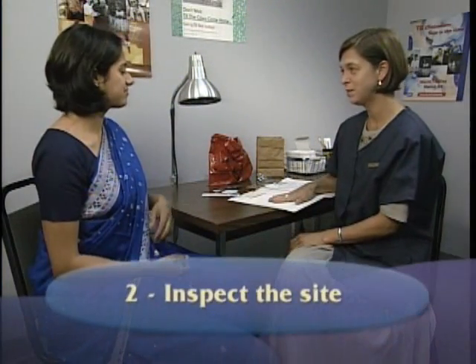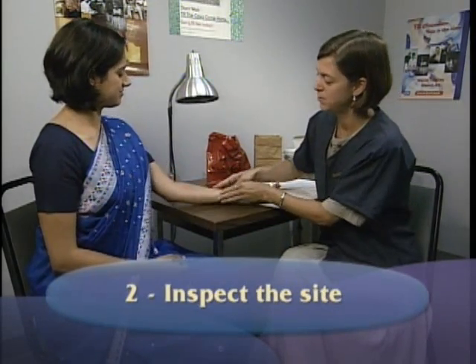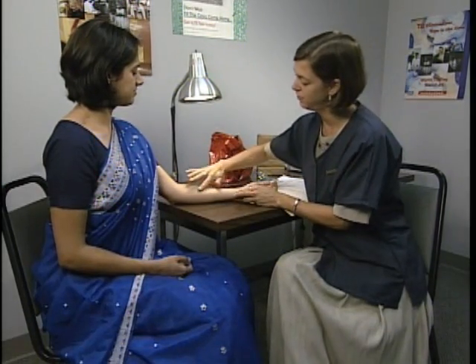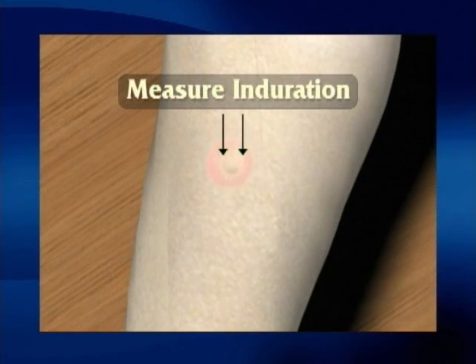To locate this skin test site, inspect the arm in good light and on a firm surface. When the site is on the forearm, turn the arm palm up, support it, and slightly flex it at the elbow. The basis of reading the skin test is the presence or absence of induration, which is a hard, dense, raised formation. This is the area that is measured.